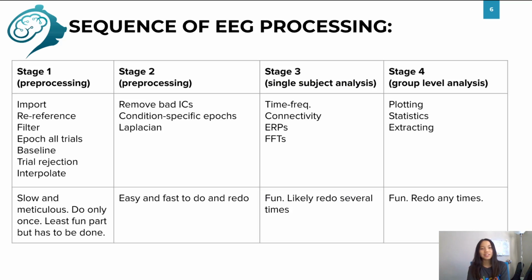Alright, so these are the stages for EEG processing. This is not necessarily the exact ordered procedure that you have to adopt, so it's mainly up to you and what your goal is. You can deviate from the exact sequence of processing. The order and which ones you do depends on the specific experiment, the types of equipment you have, and so on.